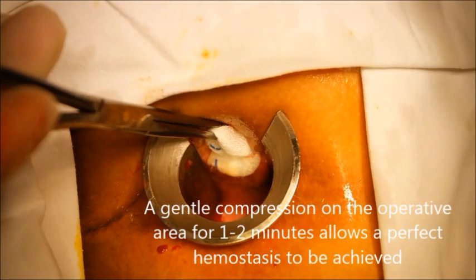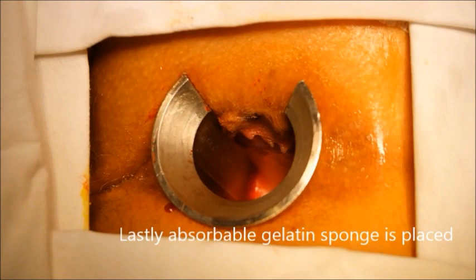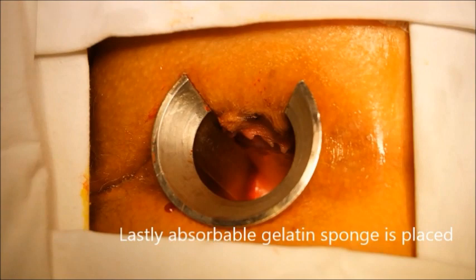A gentle compression on the operative area for 1-2 minutes allows perfect hemostasis to be achieved. Lastly, absorbable gelatin sponge is placed.